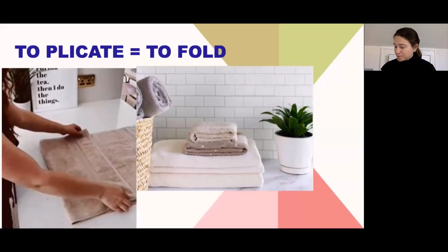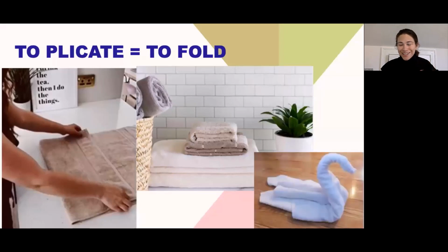Just to demonstrate today, I made a model with a towel. This is a salad bowl from my kitchen, and I just drew the iris and the pupil on it. And here is a dish towel that I put some ciliary arteries on. The idea of the surgery in a plication is to pass sutures through whatever distance we're plicating, and then attach that plication level to the original insertion so that none of the arteries are cut or interrupted. You can fold it this way with the excess muscle underneath, or you could fold it this way with the excess muscle on top. I'll show you some videos and we'll talk more about technique as we go. One thing we don't want to do in plications is get too fancy. We're not going to make anything complicated, no animal shapes when we're folding rectus muscles.